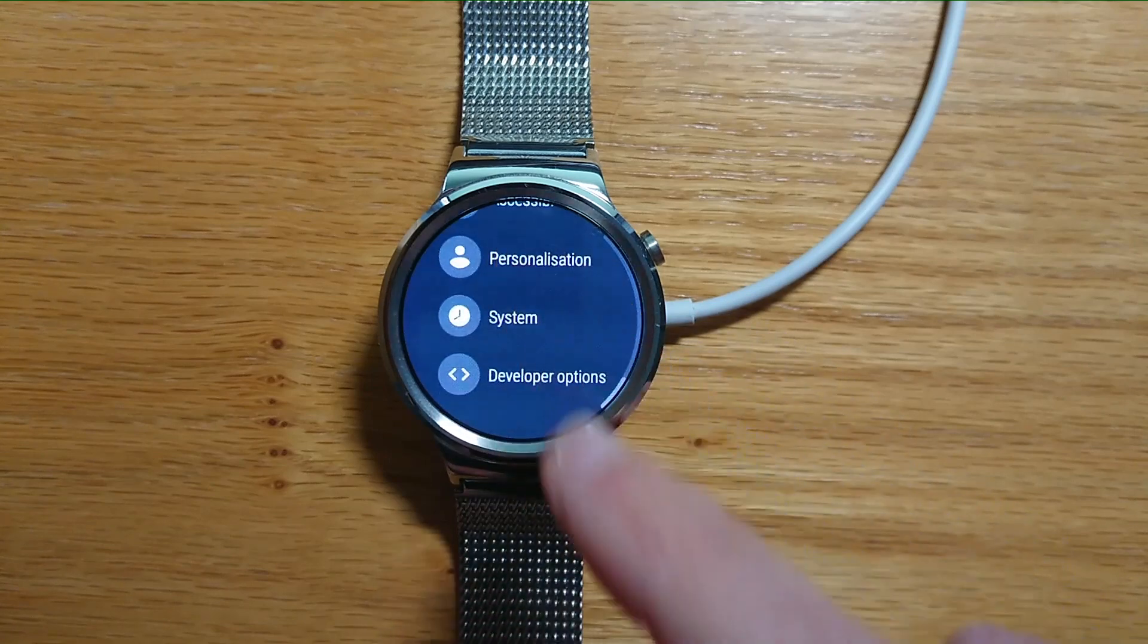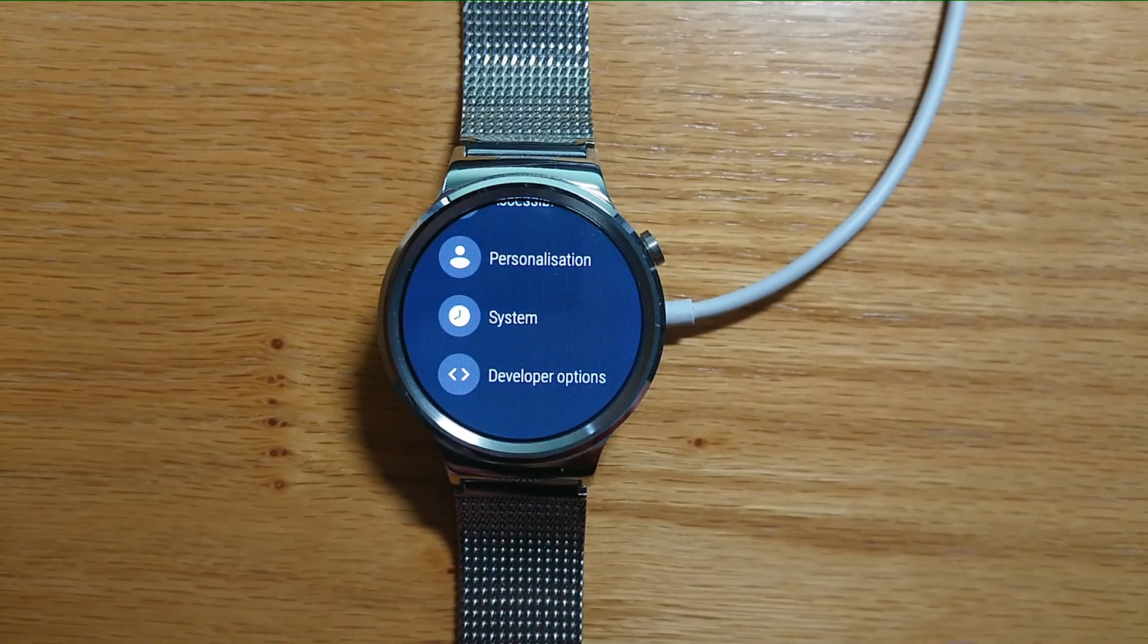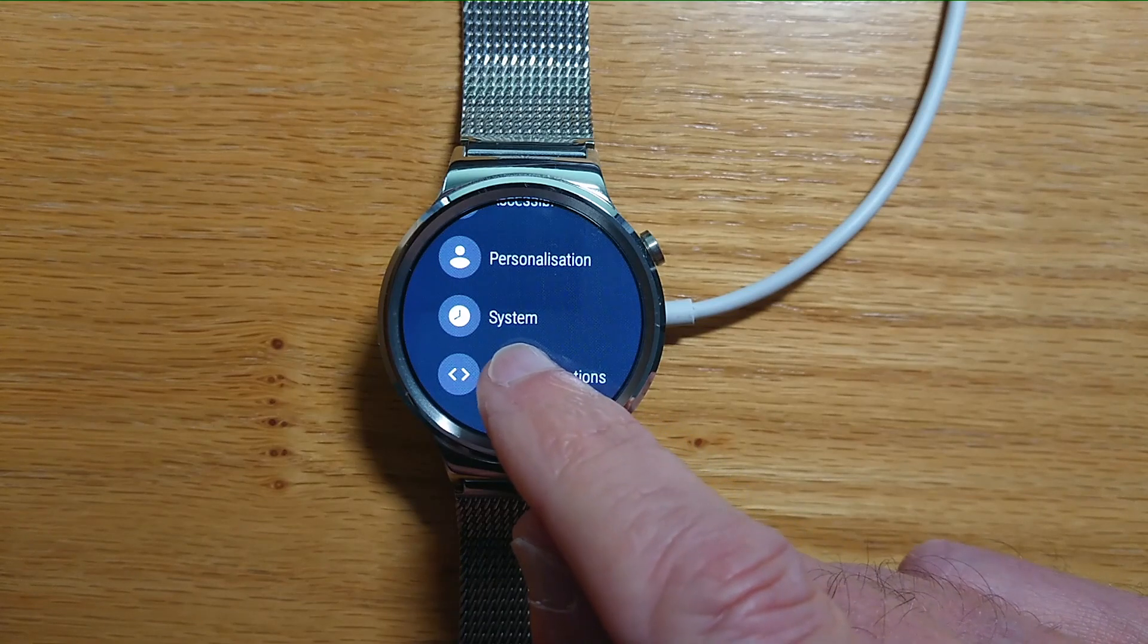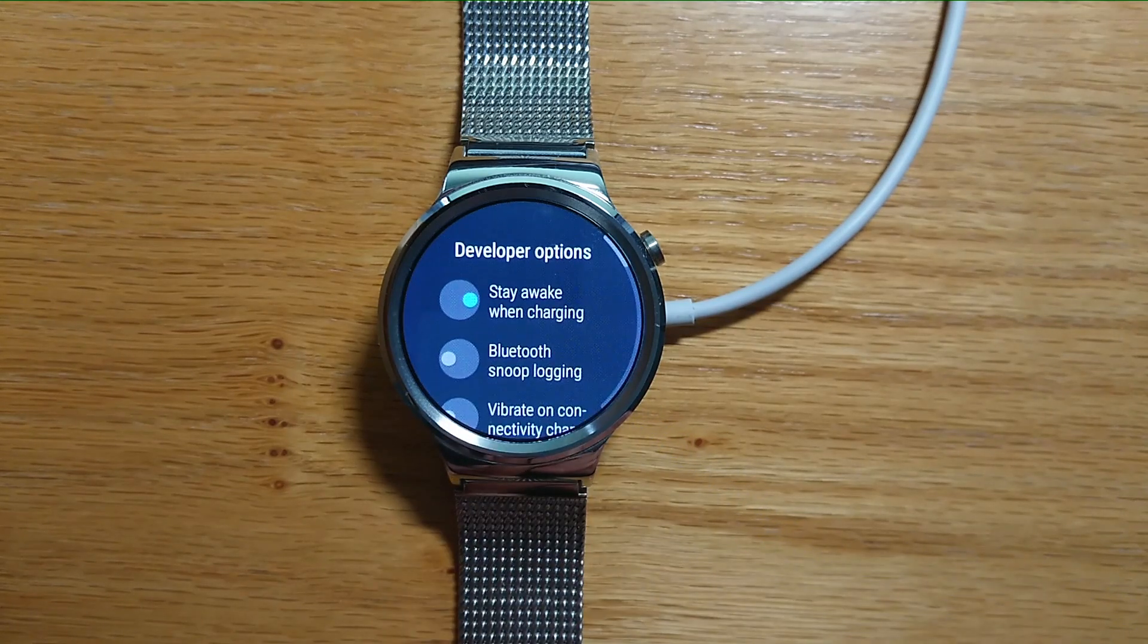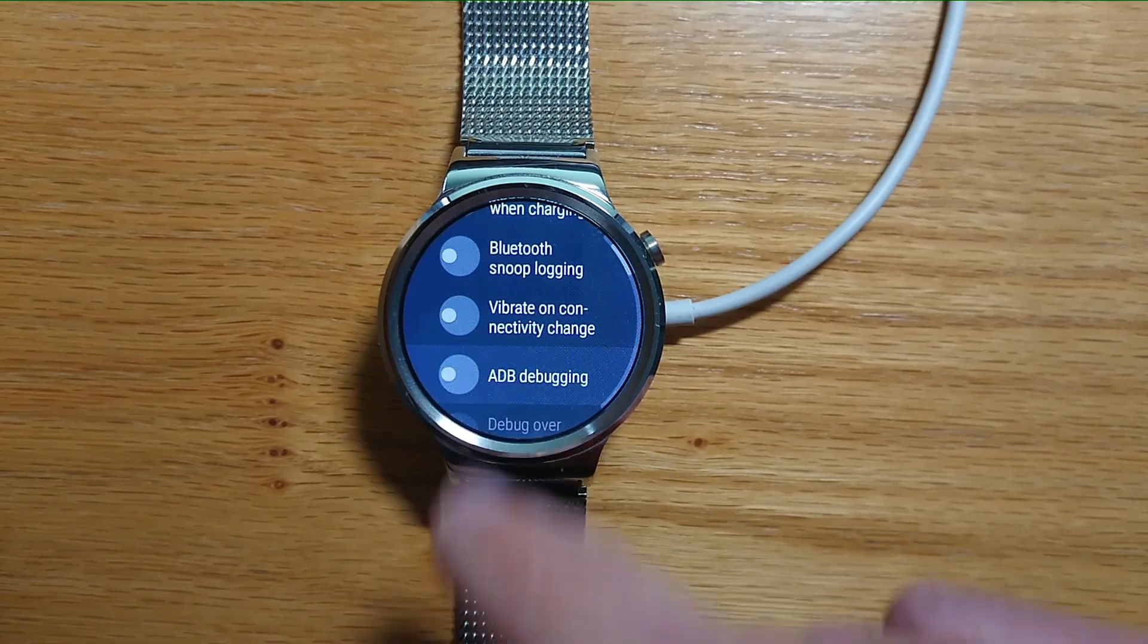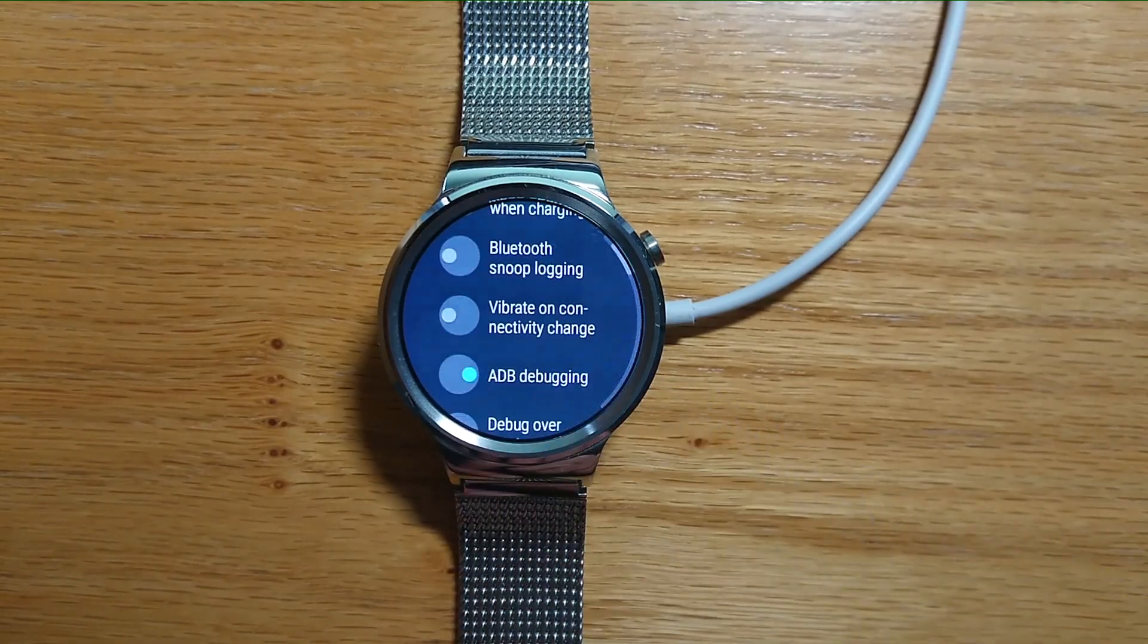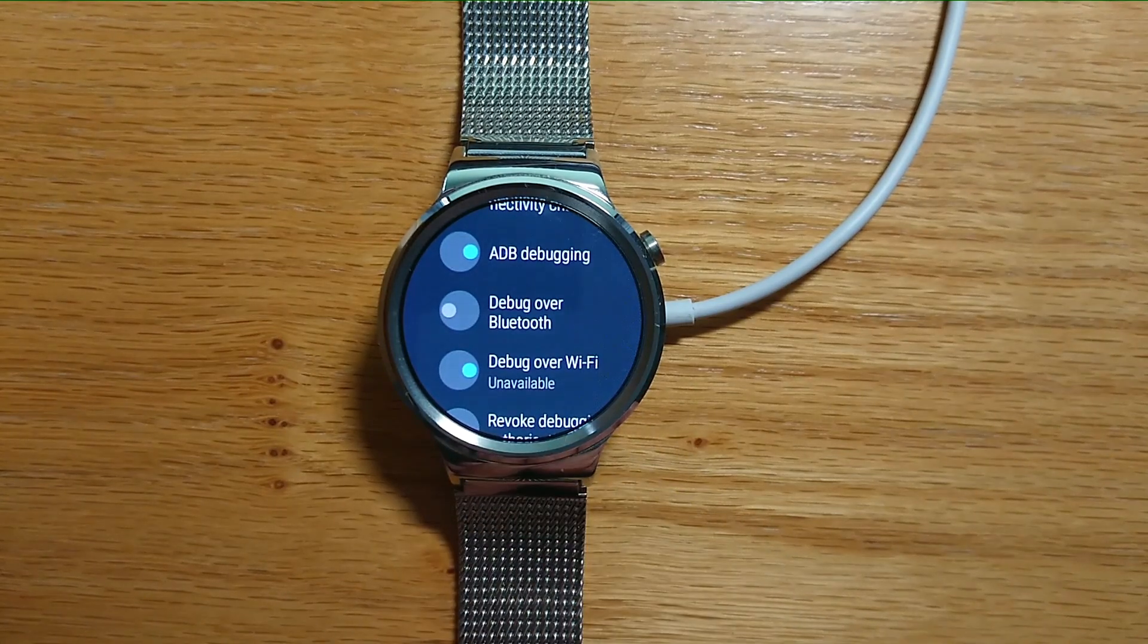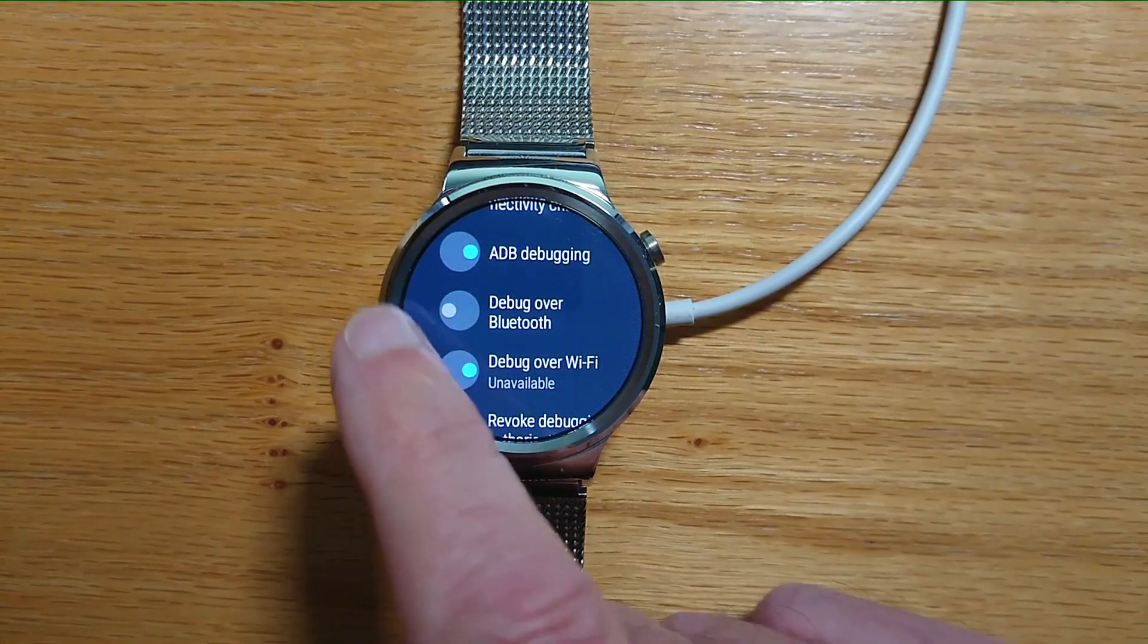Now you'll find Developer Options has been added to the menu. Let's go into it and enable ADB debugging. Yes, I'm sure. Make sure that Debug over Wi-Fi is also enabled.